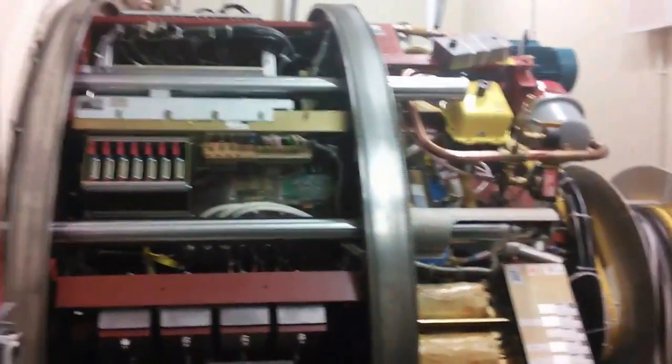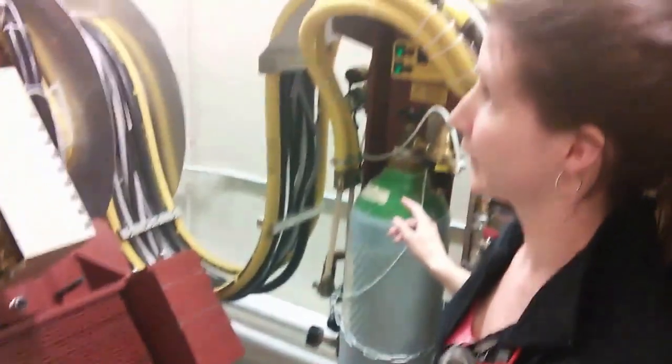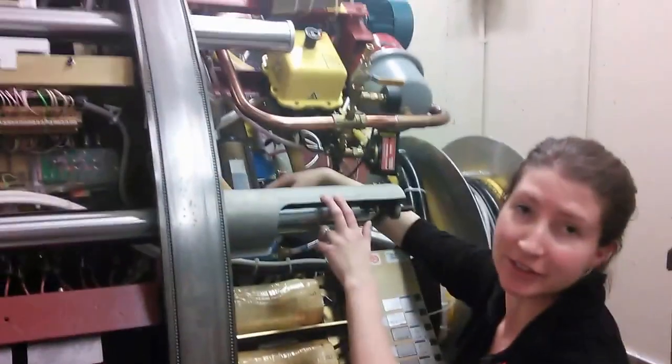This is our gas assembly. We also use water and cooling. And so you can see we have our water filters here that we're going to change out on our PM.